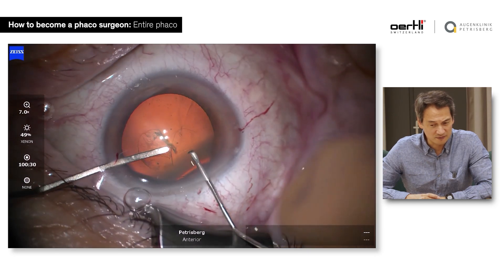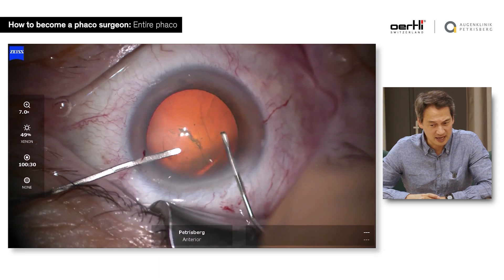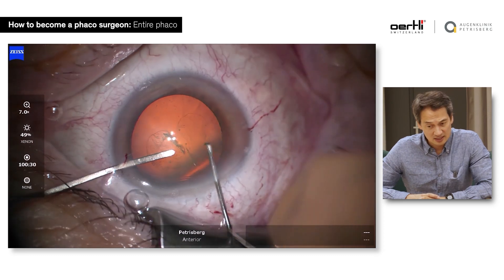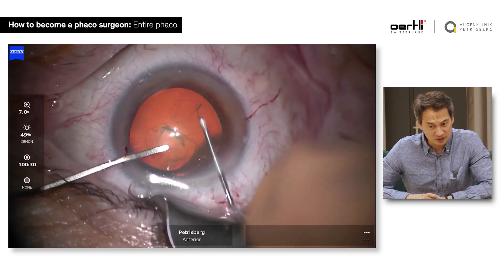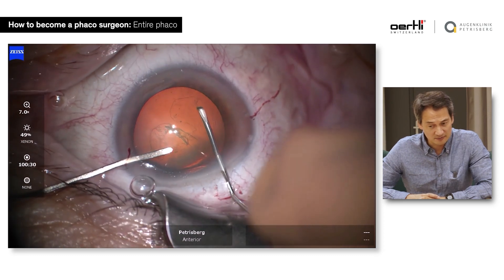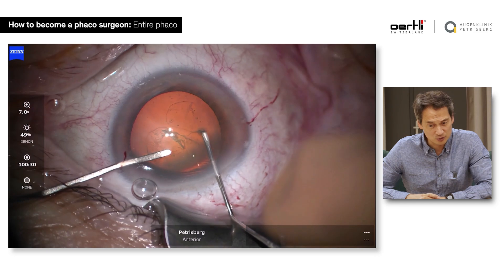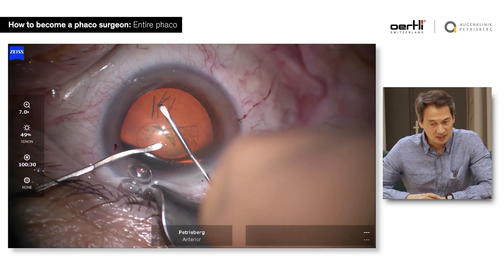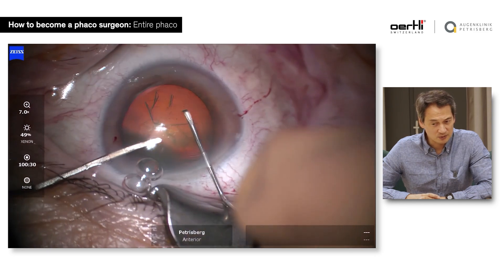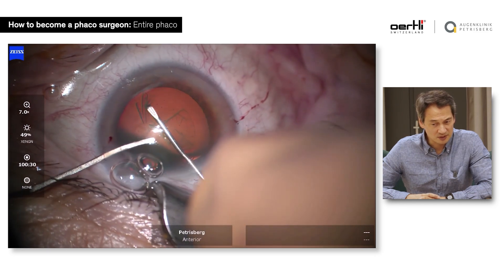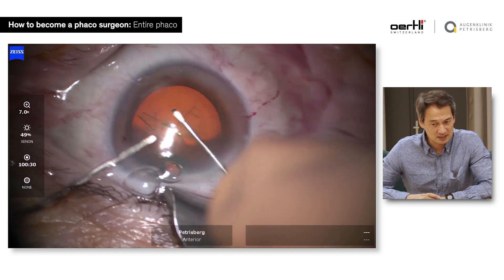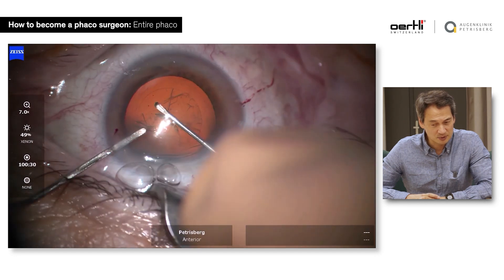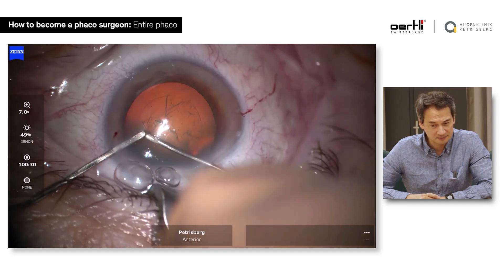The temporal approach is, for me, mandatory and standard. It has been discussed extensively in the literature regarding reduction of positive astigmatism. It's very clear to do it and there's no excuse not to — but whatever suits you best.